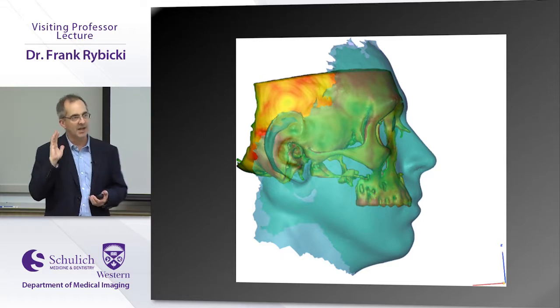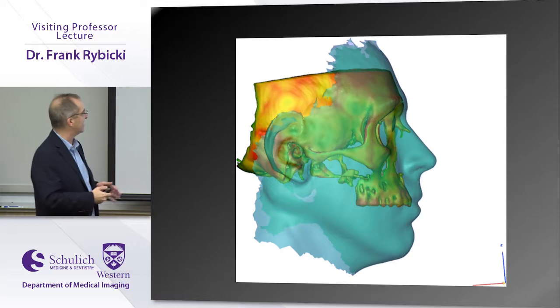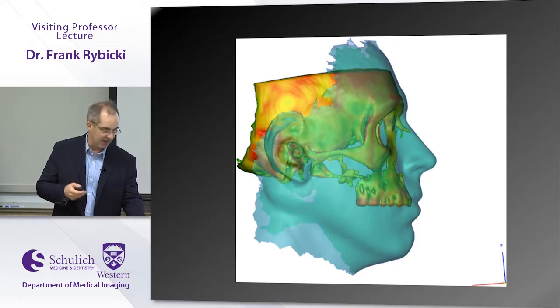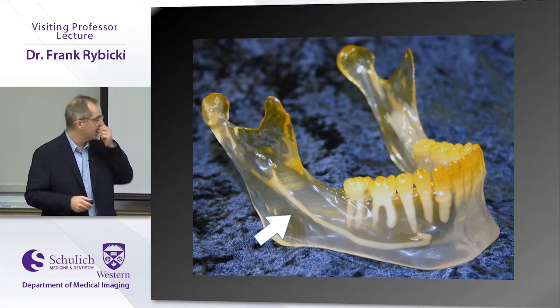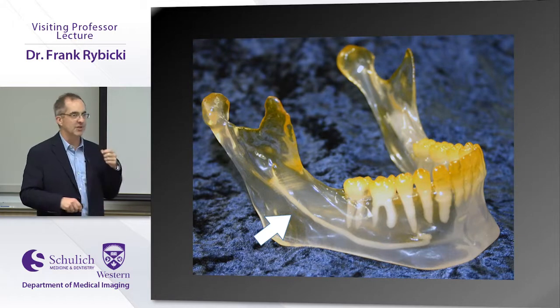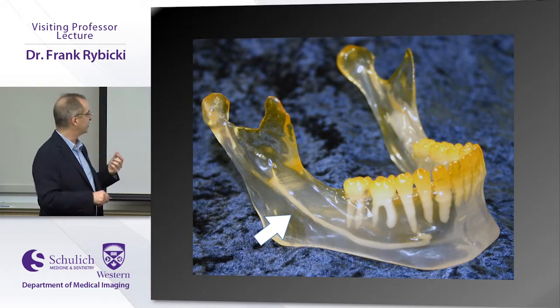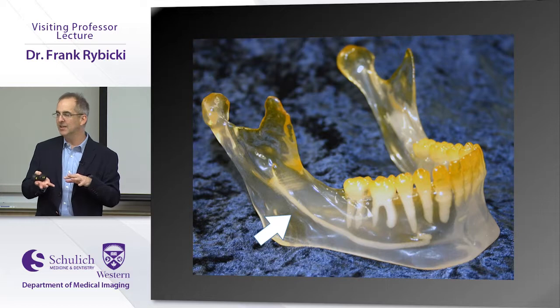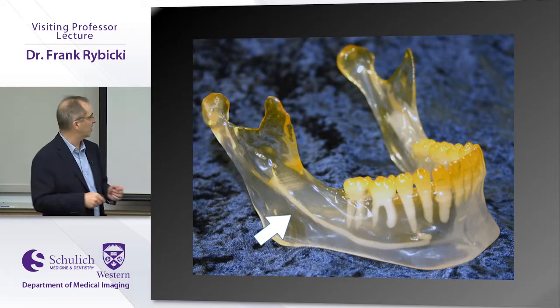Then you can overlay the rotational photography on the CT scan and plan out the surgery. We make ears this way. We make parts of faces this way. You can reconstruct the soft tissues this way. You can, with different tricks, take printers that are actually pretty cheap, and take the material, the resin, and over or underexpose it in certain ways so it looks like the nerves, and so you can actually show where the nerves are.